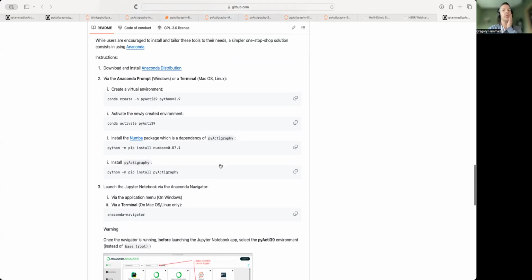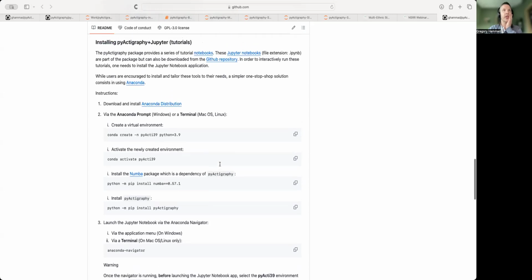Okay, so good so far. I hope that the instructions were clear to everyone. Maybe a little bit of details here if you're not familiar with Python. I hope you are. I see that someone is there also asking for instruction link.